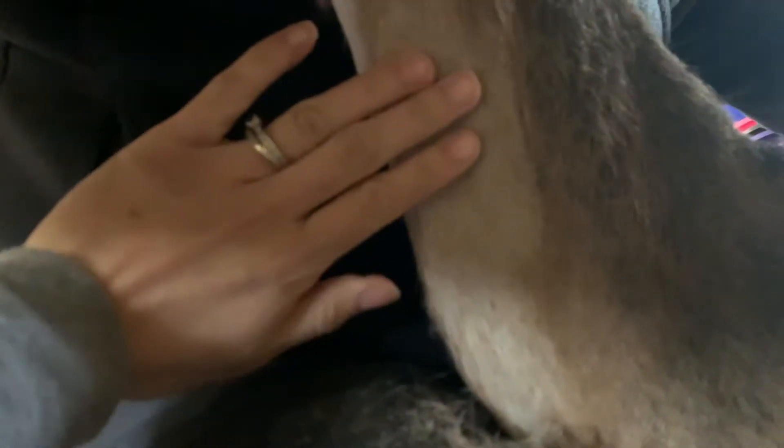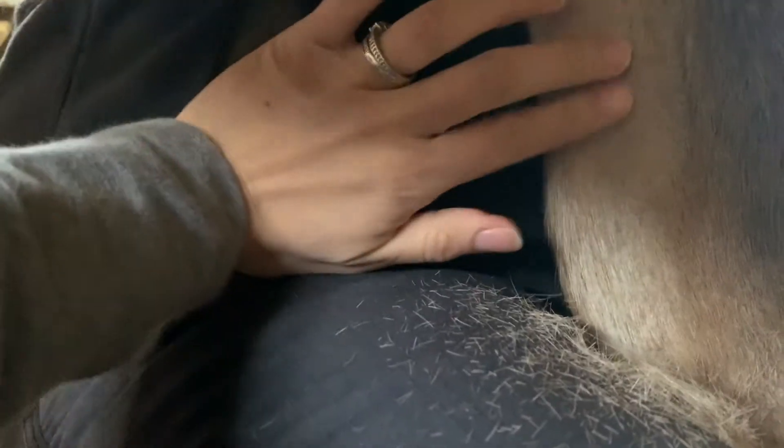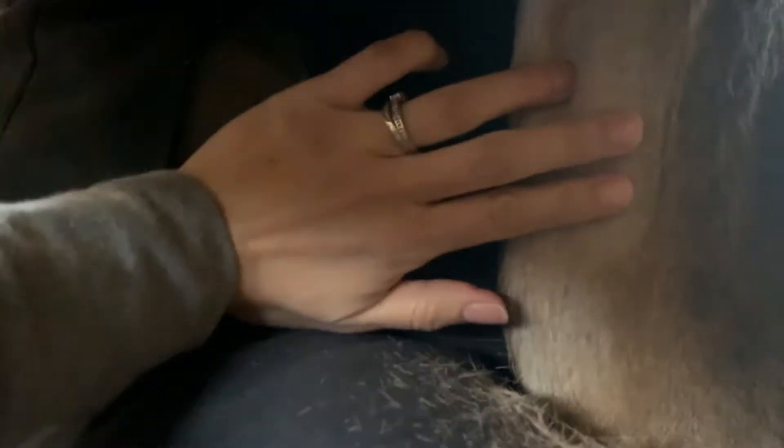She is fighting — probably don't have this on camera, but I'll show you after. All right, so I got this area right here shaved and you can feel the vein right there.